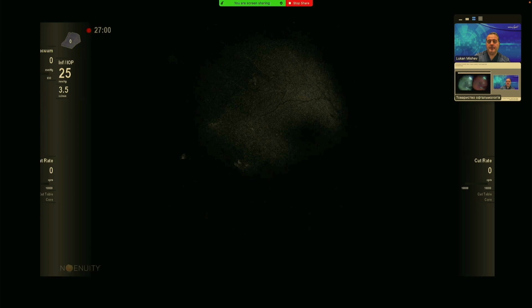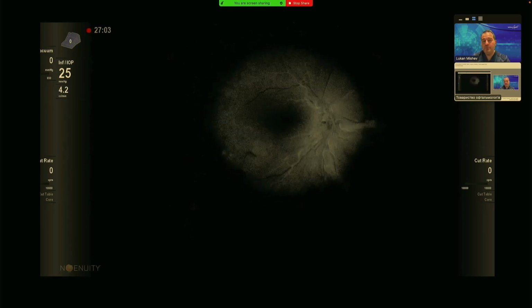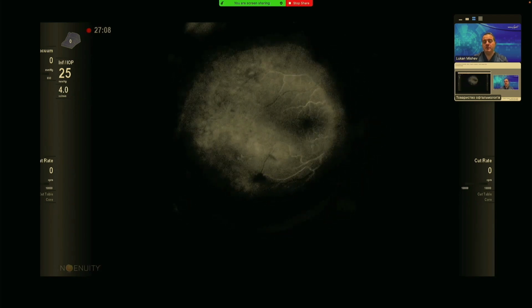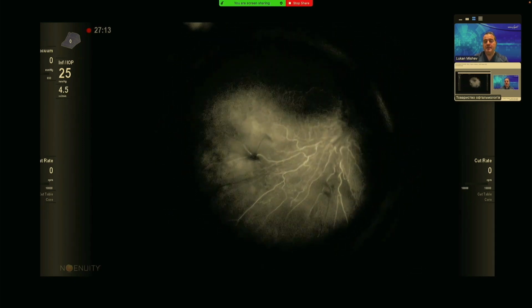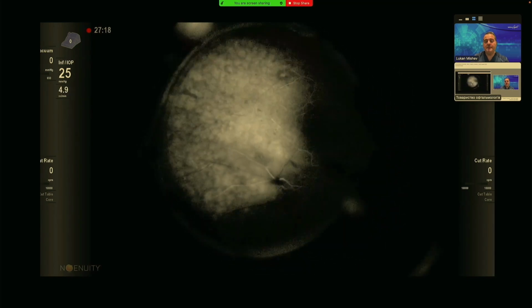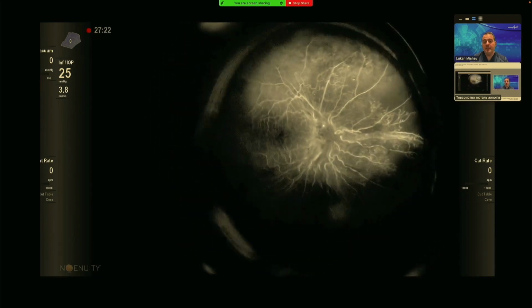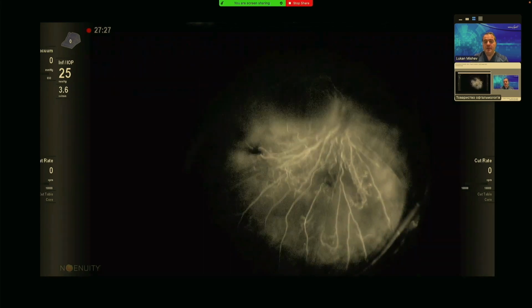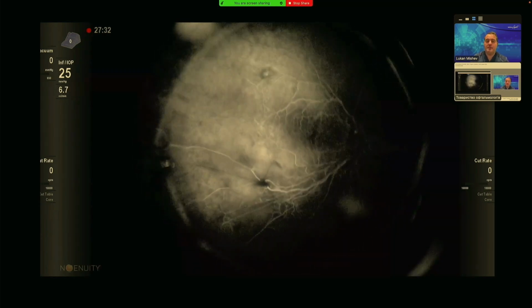The next image, which is quite new, is actually intraoperative fluorescein angioscopy. It is angioscopy because it is continuous imaging, and you can appreciate here in this diabetic case the capillary dropout, the lack of perfusion in some areas, and good perfusion in other areas, which might determine our behavior later, meaning PRP and specific areas which we need to treat with laser also.